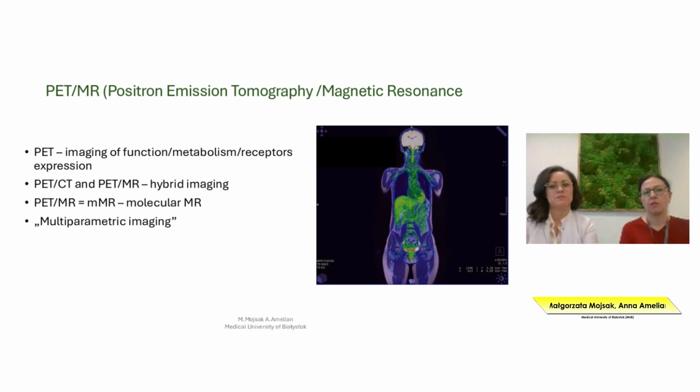So depending on the tracer, PET-CT, PET-MR is hybrid imaging technology. PET-MR is used in multiparametric imaging.